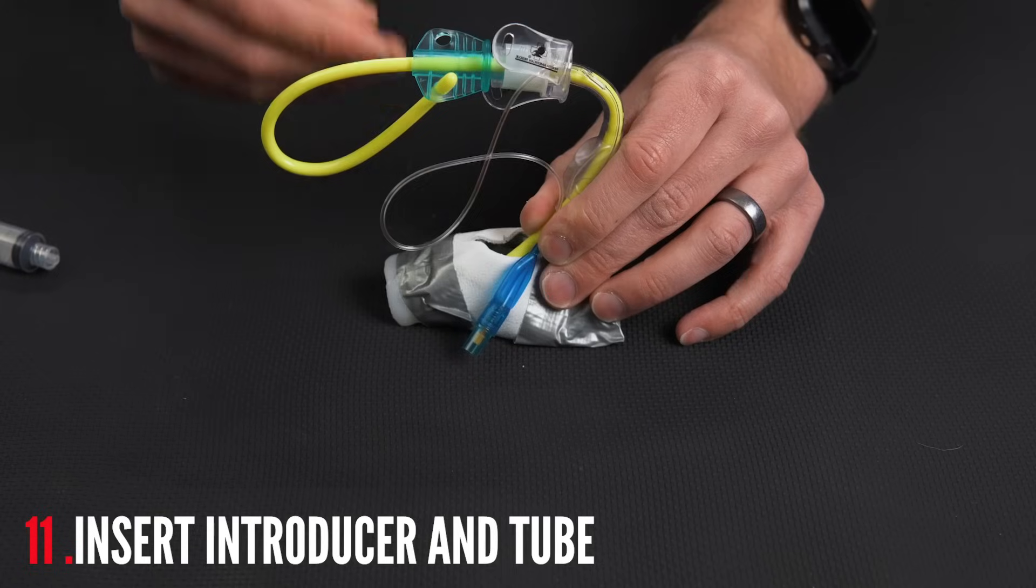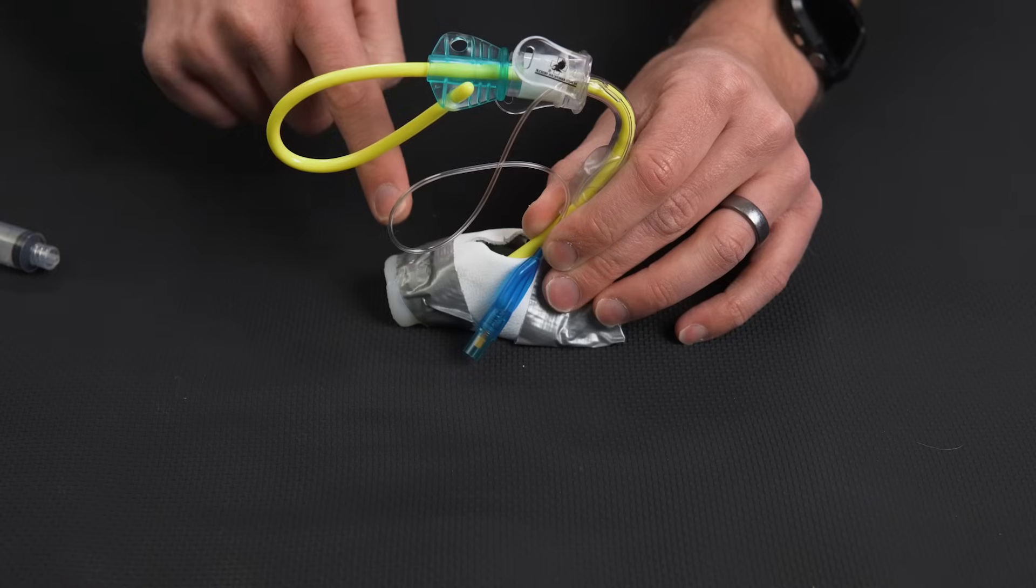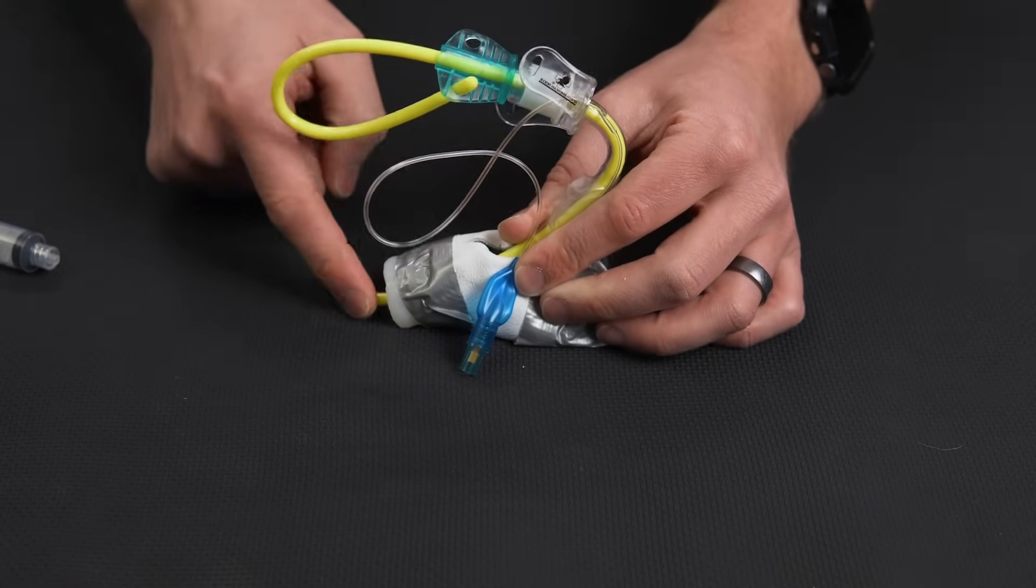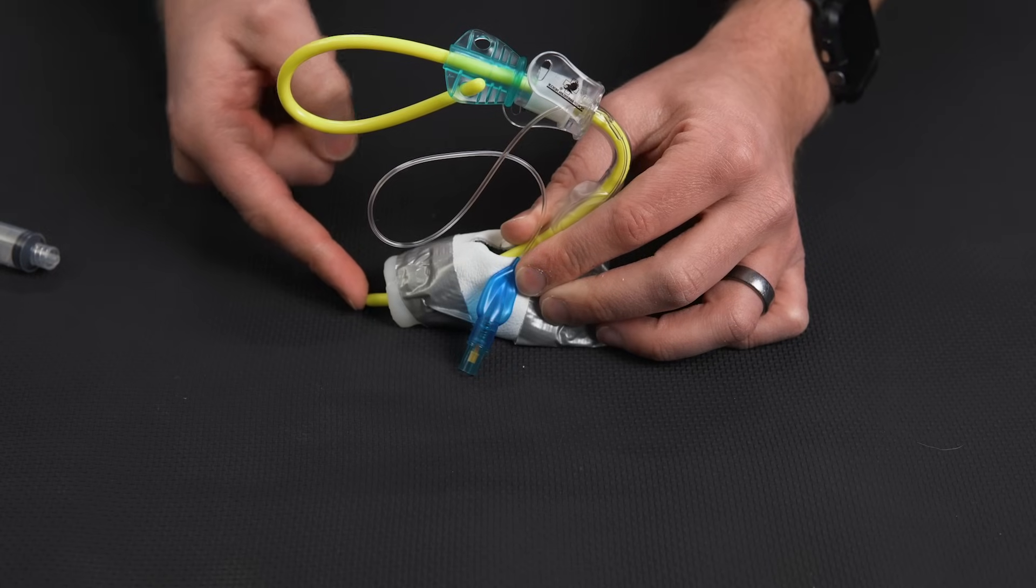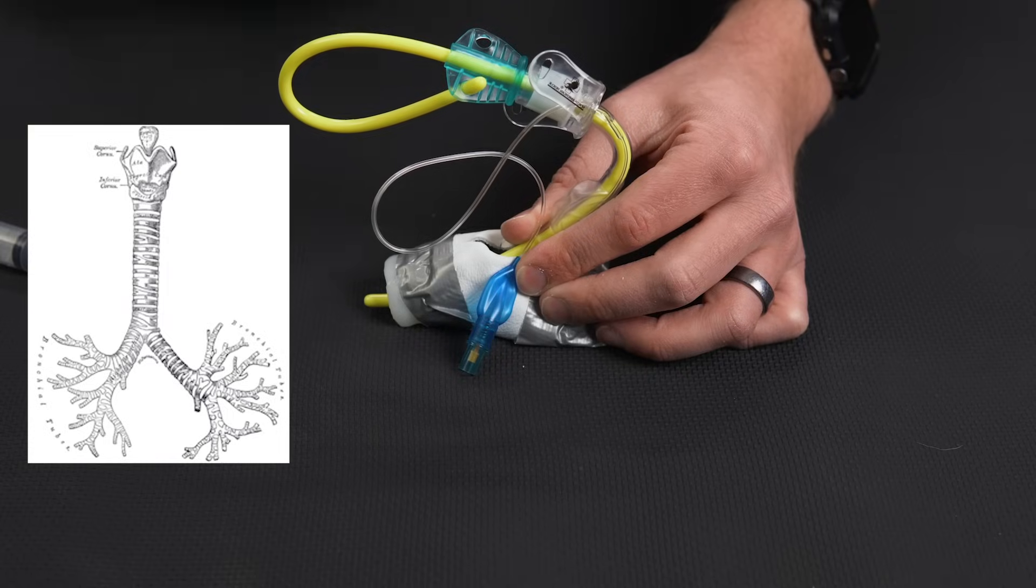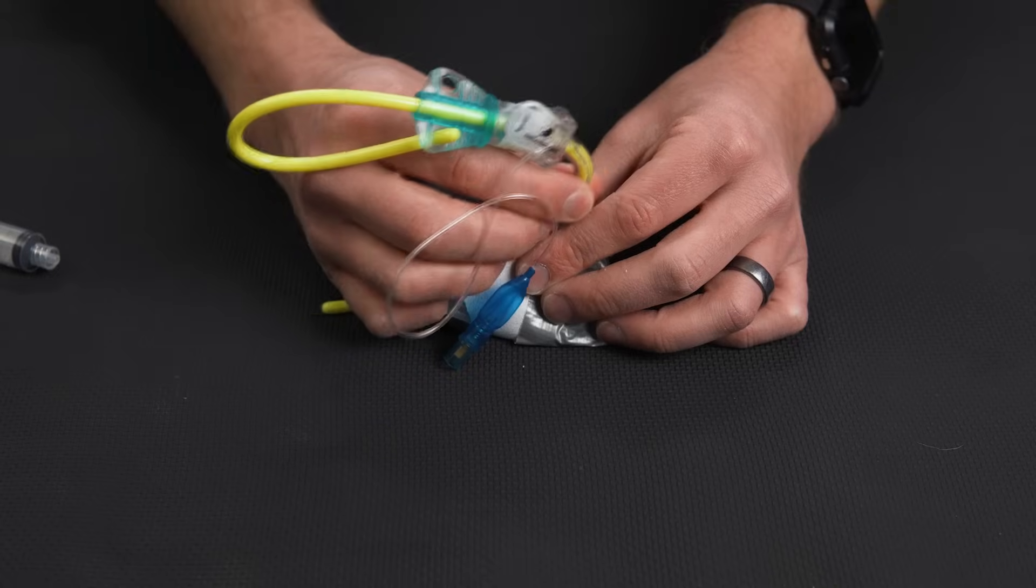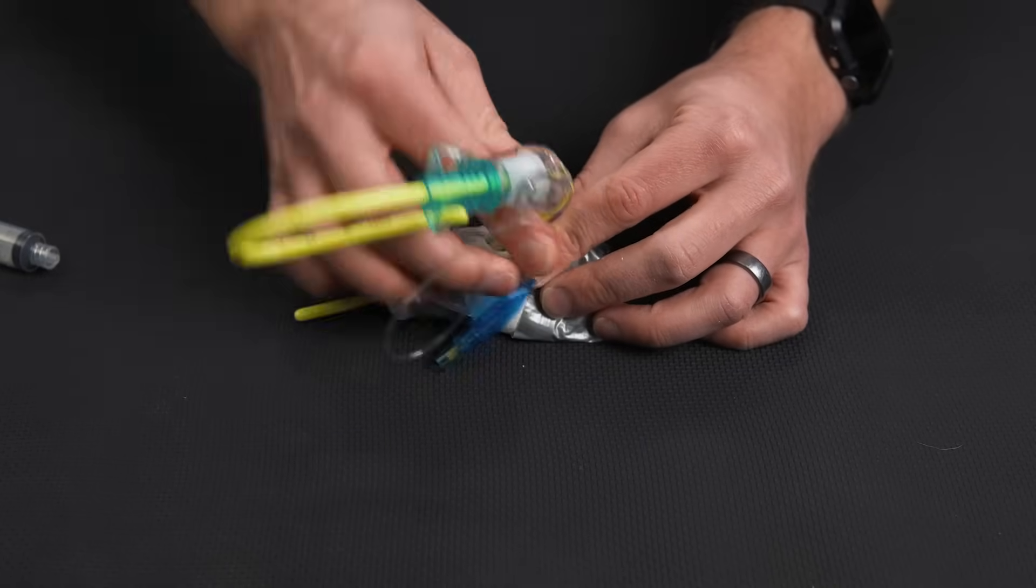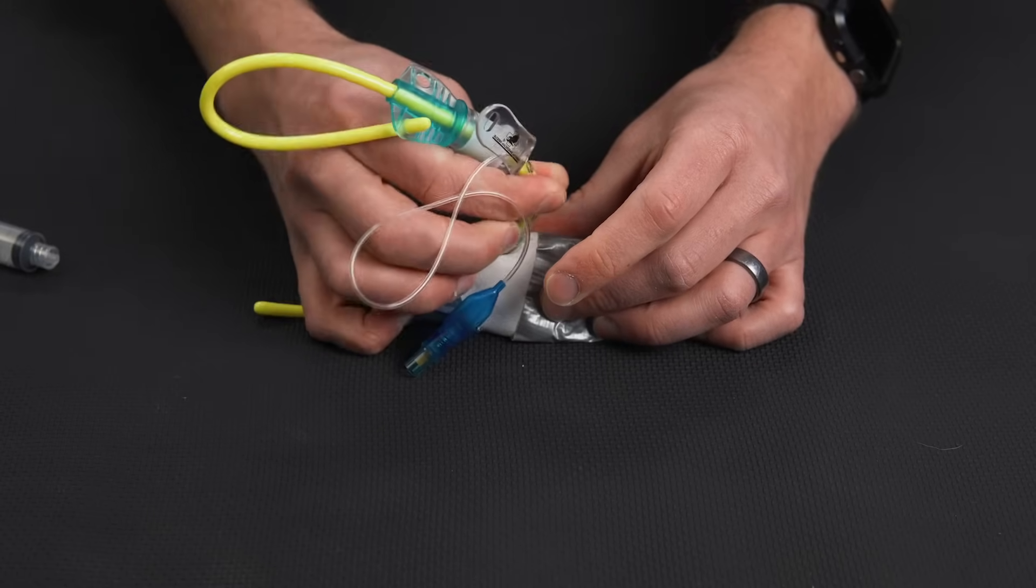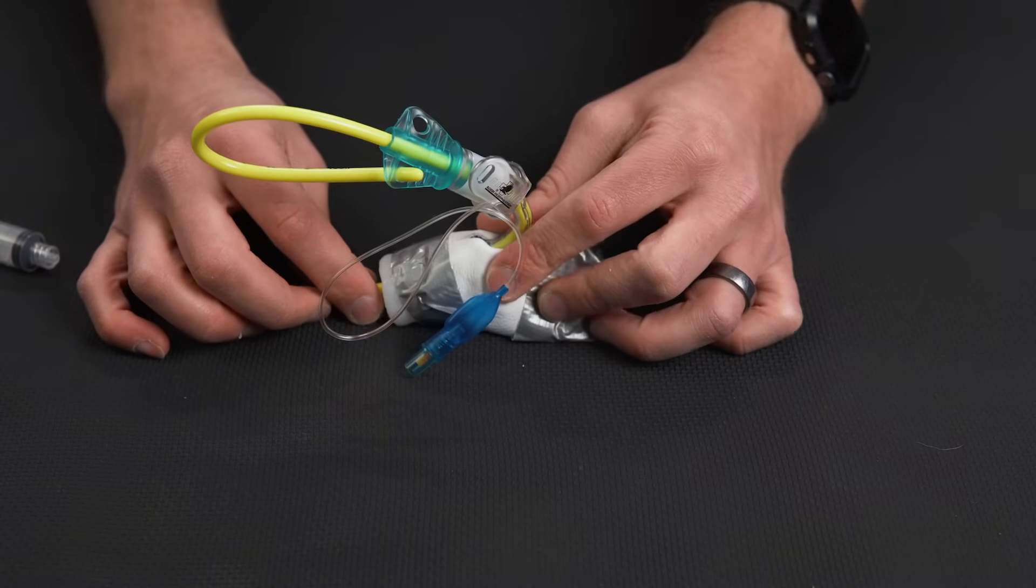I can then take my tube with the bougie preloaded and I'm going to just take the bougie and slide that in next to my finger. As we go in, that coude tip, that little angled tip of the bougie should start bumping off the tracheal rings. That's another confirmation technique. As we put this in, eventually the bougie, if it's in the right place, is going to hit what's called the carina, which is the bifurcation where your bronchioles come off to either lung. That should hit that and it should stop.